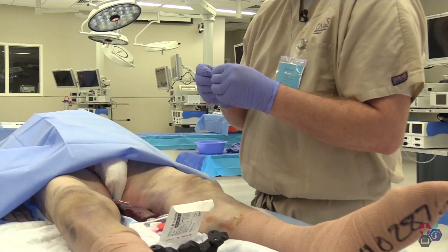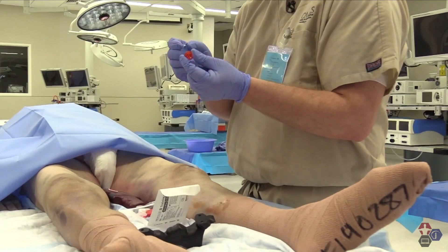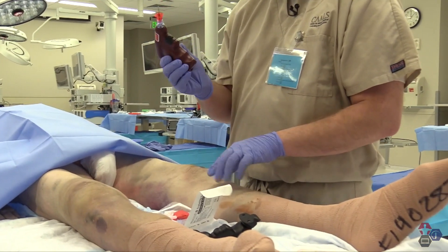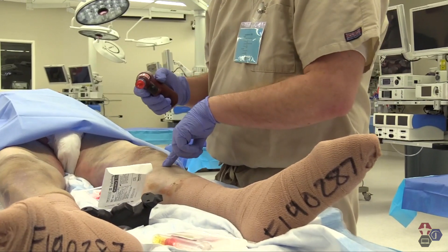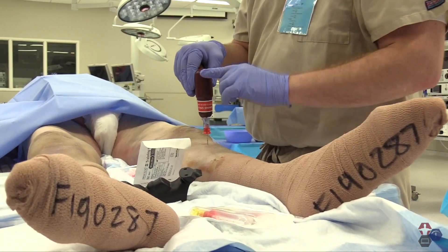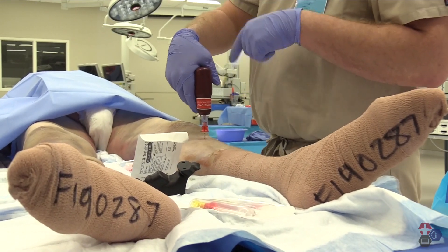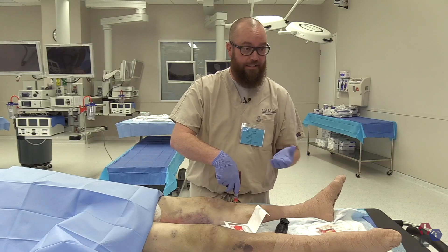This is the 25 millimeter needle. There is a safety cap, and the stylet sits in the middle of the needle. You remove the safety cap and place the needle on the driver. The technique is two finger breadths down from the tibial tuberosity and two finger breadths medial. At this point you want the driver 90 degrees, or perpendicular, to the bone mass itself. Push the needle through the tissue until you hit bone, then pull the trigger on the drill without applying any downward pressure.